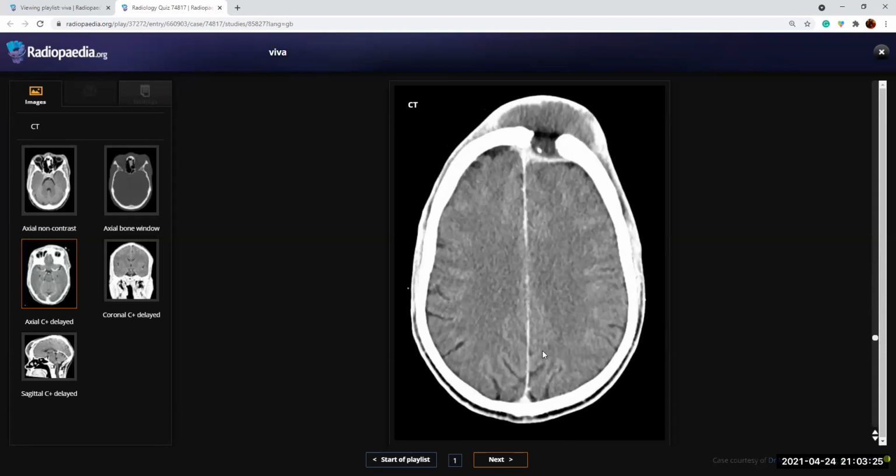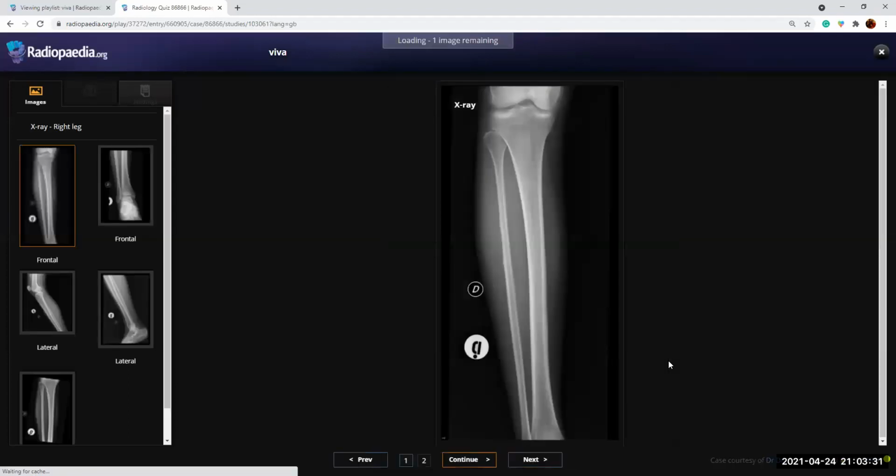Stop scrolling one second. I'll just take the mouse. Yeah. You can continue saying. I'll just go to the next case. So what do you think should be done for this case? So for this, I think I'll refer this patient to the on-call neurology team, and they might take a sampling from this procedure and send it for culture sensitivity and treat accordingly, for AFB culture and staining.